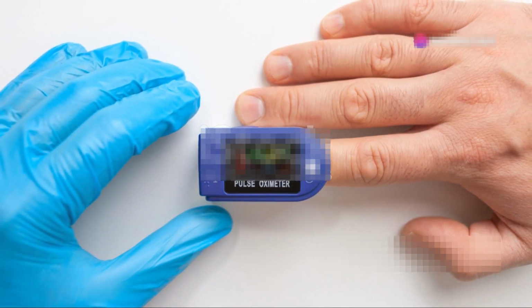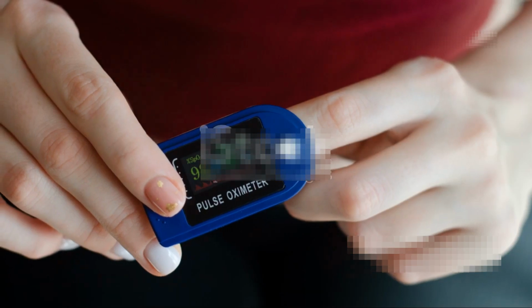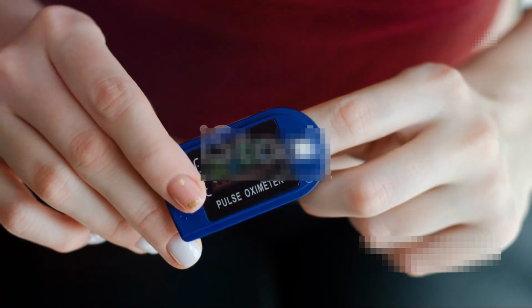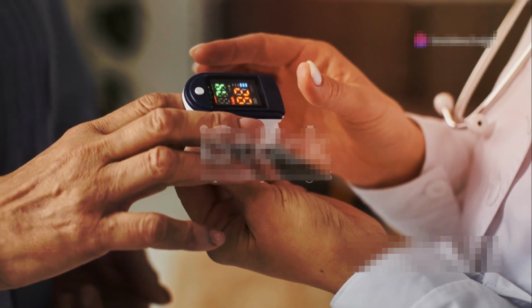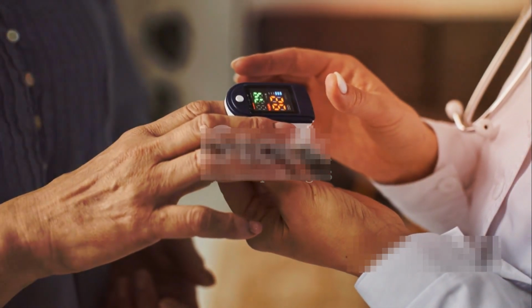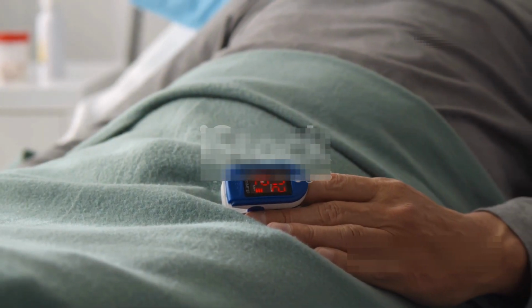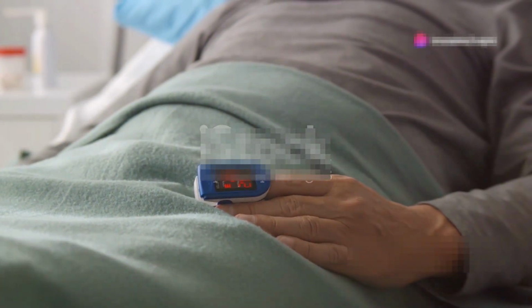Putting it all together, you can determine if the issue is respiratory or metabolic and whether it's acidosis or alkalosis. For example, if the pH is low and PaCO2 is high, it's respiratory acidosis. If pH is high and HCO3 is high, it's metabolic alkalosis. Remember, interpreting blood gas reports is like solving a puzzle. Look at all the pieces, pH, PaCO2, PaO2, HCO3, and SaO2, and see how they fit together. With practice, you'll get the hang of it.